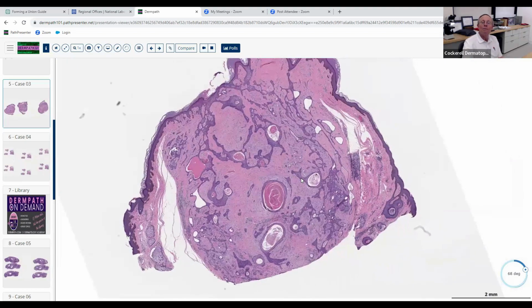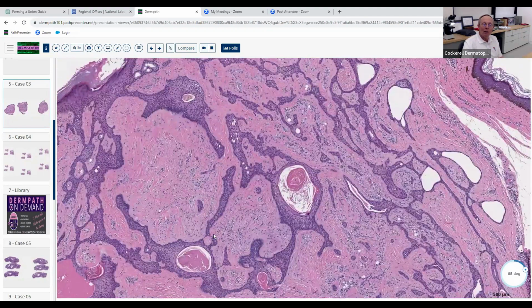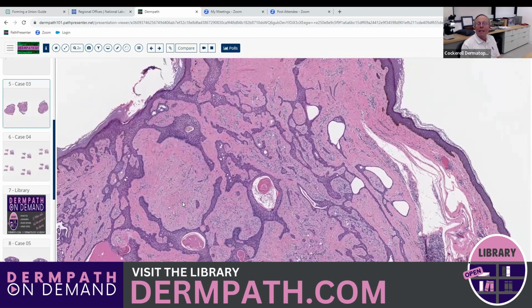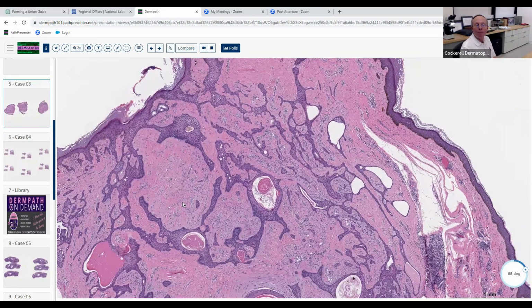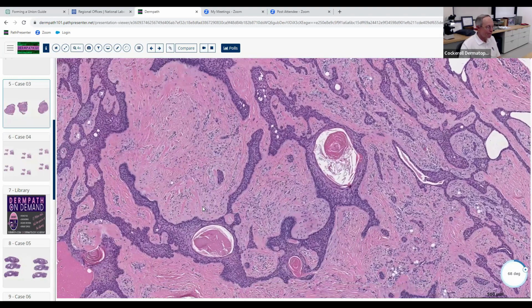Could we get this on the board? What are a couple of other follicular hamartomas that can look a little bit like this area right here, where you get prominent stroma and these little strands of residual follicular epithelium over here, that can be associated with renal cell carcinoma, and also emphysema, blebs in the lung that rupture? And they get multiple papules on their body and their face.